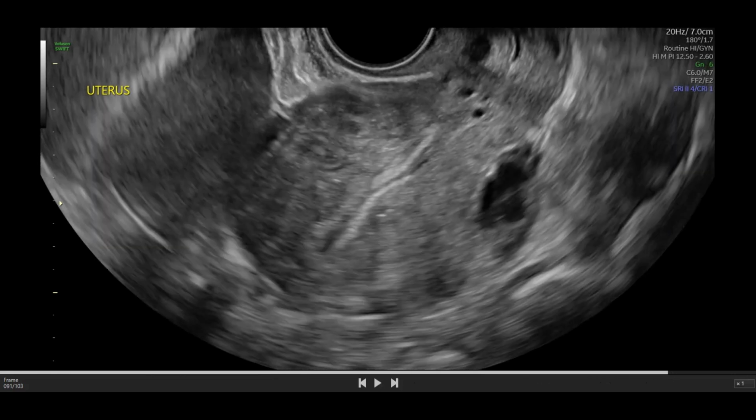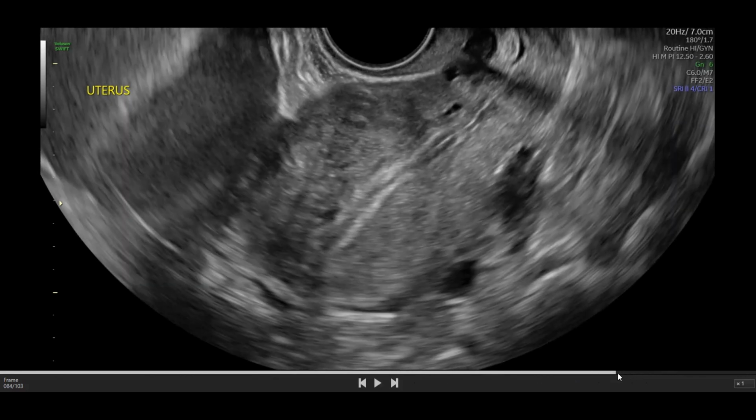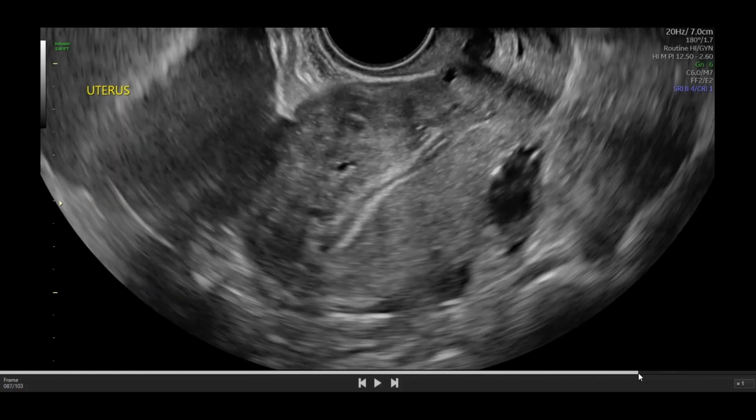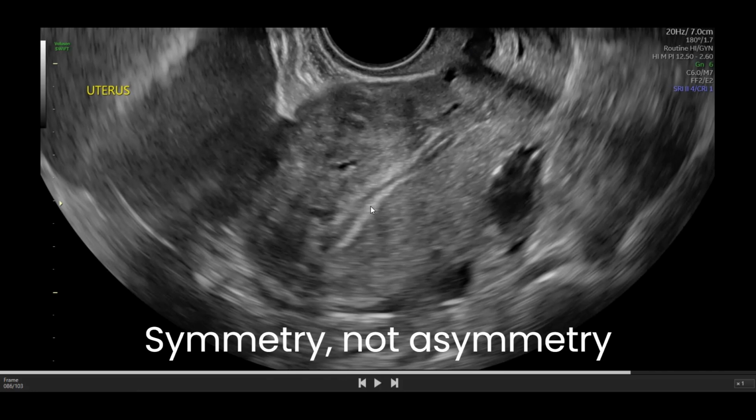This uterus may be on its way to being a really globular uterus. It's not quite super globular. We do have a relatively sharper angle of the cervix to uterus here, rather than a more straight, smooth line. Posteriorly, it's a lot more smooth. And we have a symmetry overall between the anterior and the posterior, nothing too dramatic there.